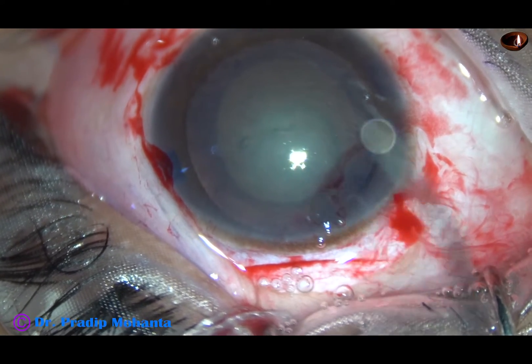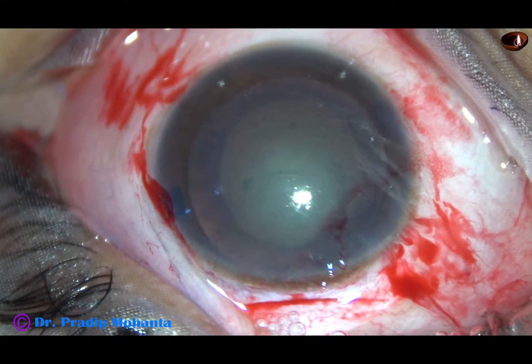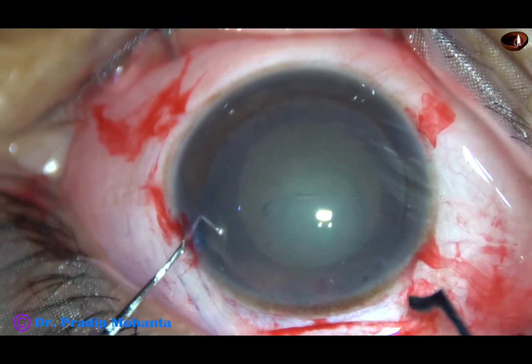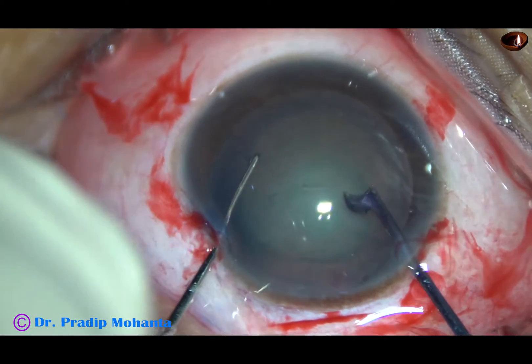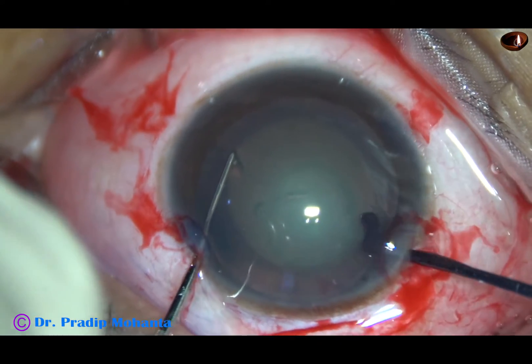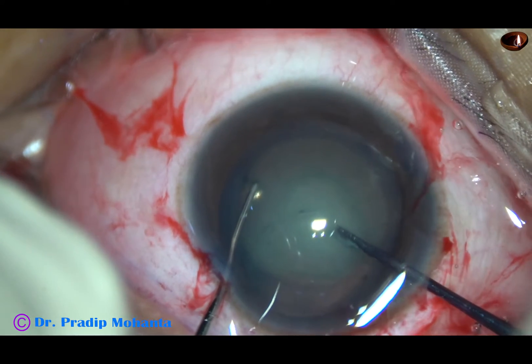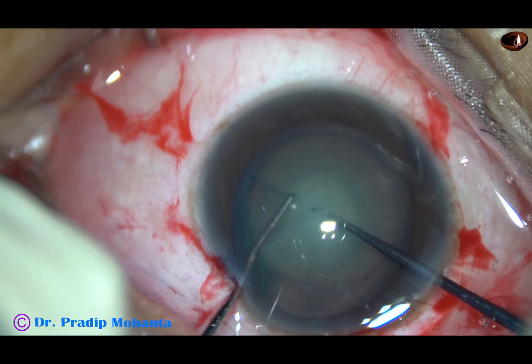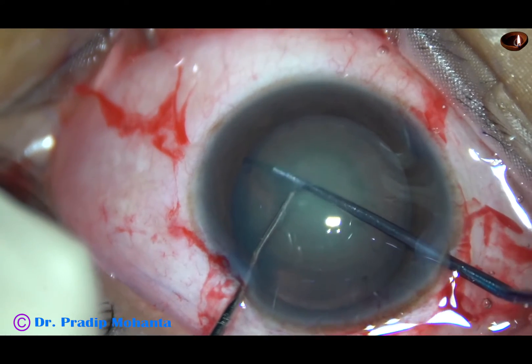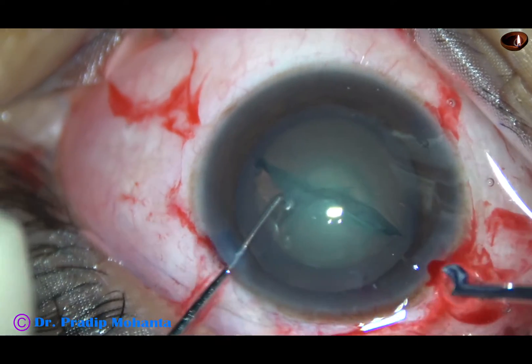Now, before hydrodissection, I am going to divide this nucleus into two halves with the help of a pre-chopper — Dr. Suhail Khan's pre-chopper. So I am going to divide this nucleus into two halves with the help of this pre-chopper.